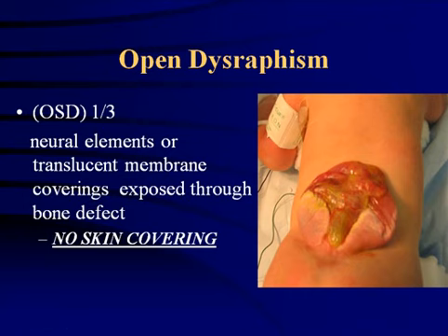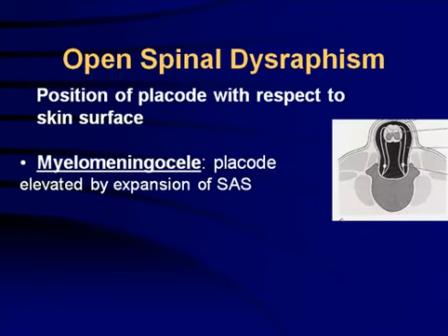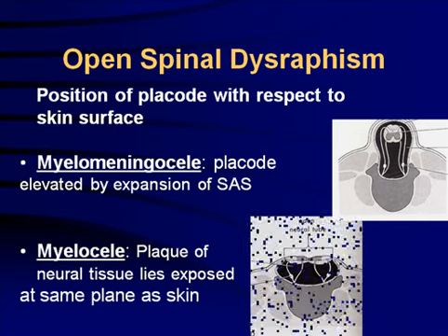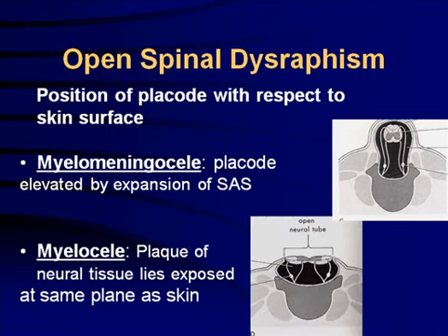An open neural tube defect has a translucent membrane with no skin covering. These are typically separated into myelomeningocele, where the placode is elevated by the expansion of the subarachnoid space, or the myelocele, which is a plaque of neural tissue that lies exposed at the same plane as the skin. Neither of these are skin covered, and both are associated with Chiari malformations.